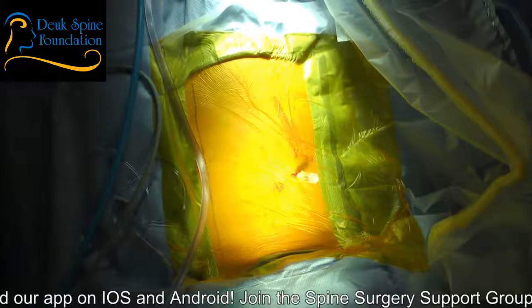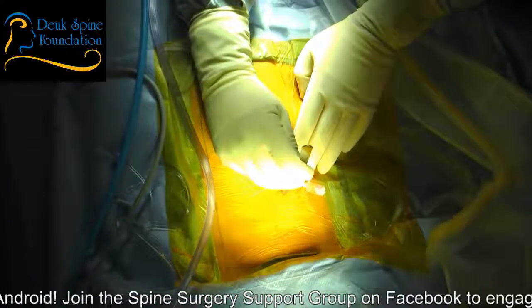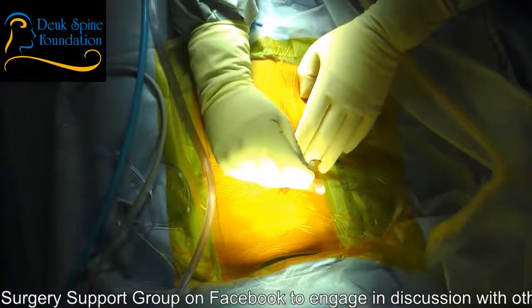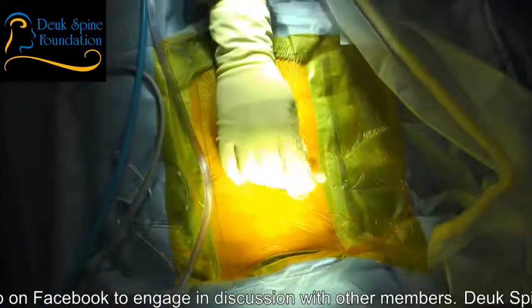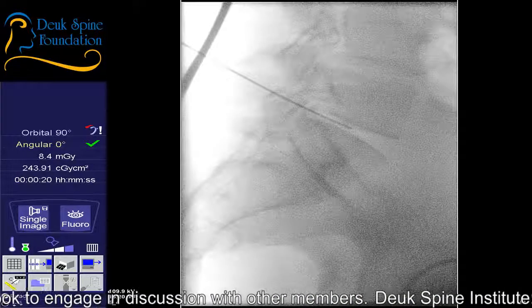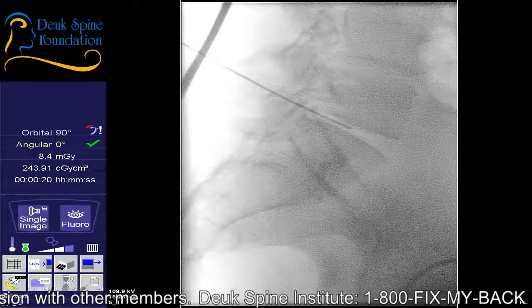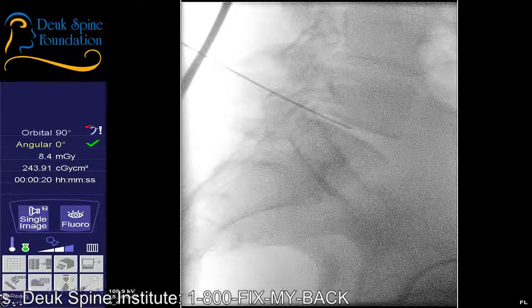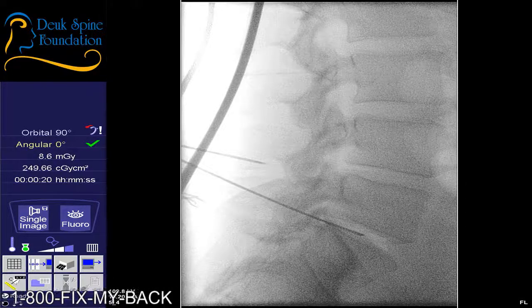All right, now let's focus on 4-5. So for those of you who are wondering, is this percutaneous surgery? The answer is no. Percutaneous surgery is done with a needle. There's a lot of misunderstanding about what percutaneous means. Strictly, percutaneous means through the skin, but percutaneous procedures are needle-based procedures. They're just done with the needle only, nothing else.